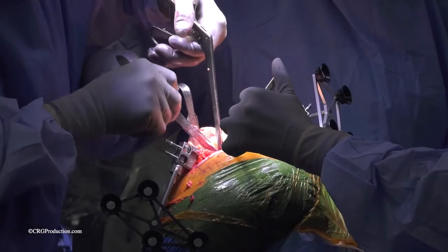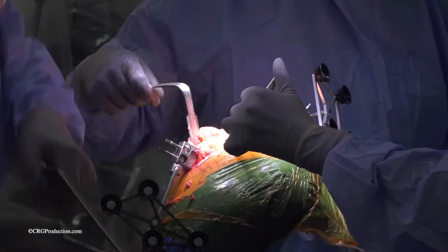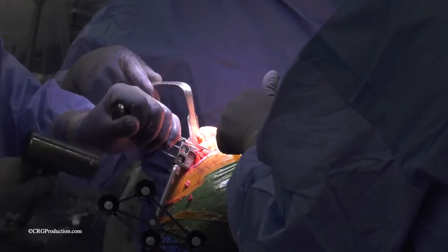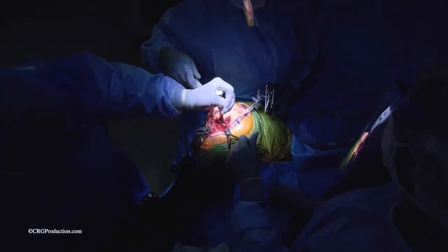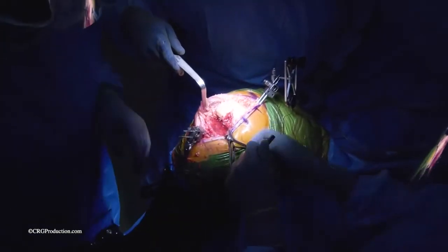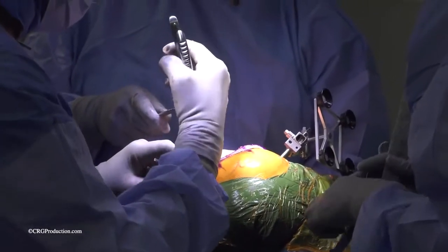It's a tight corner there, so sometimes it's a little bit difficult to remove all the meniscus tissue easily. Now it's removed. In the same manner, some of the posterior osteophytes, or the bone spurs in the back of the knee, are removed using the curved osteotome or chisel, and now fully removed with the pituitary. Now the rongeur is used along the edge of the bone to ensure a nice smooth surface for the prosthesis.